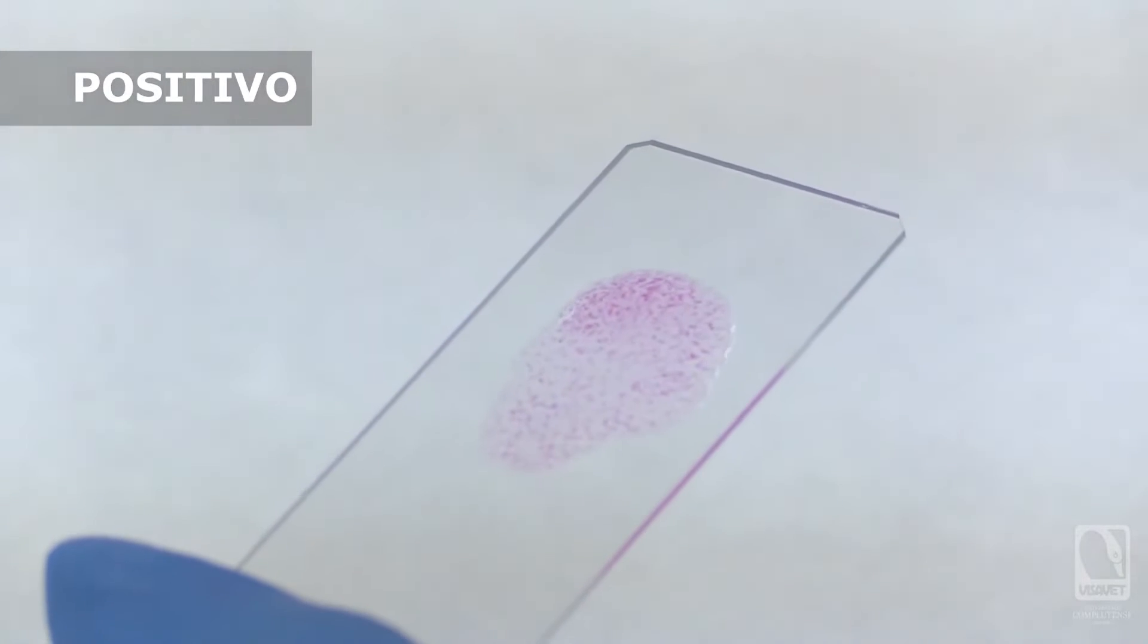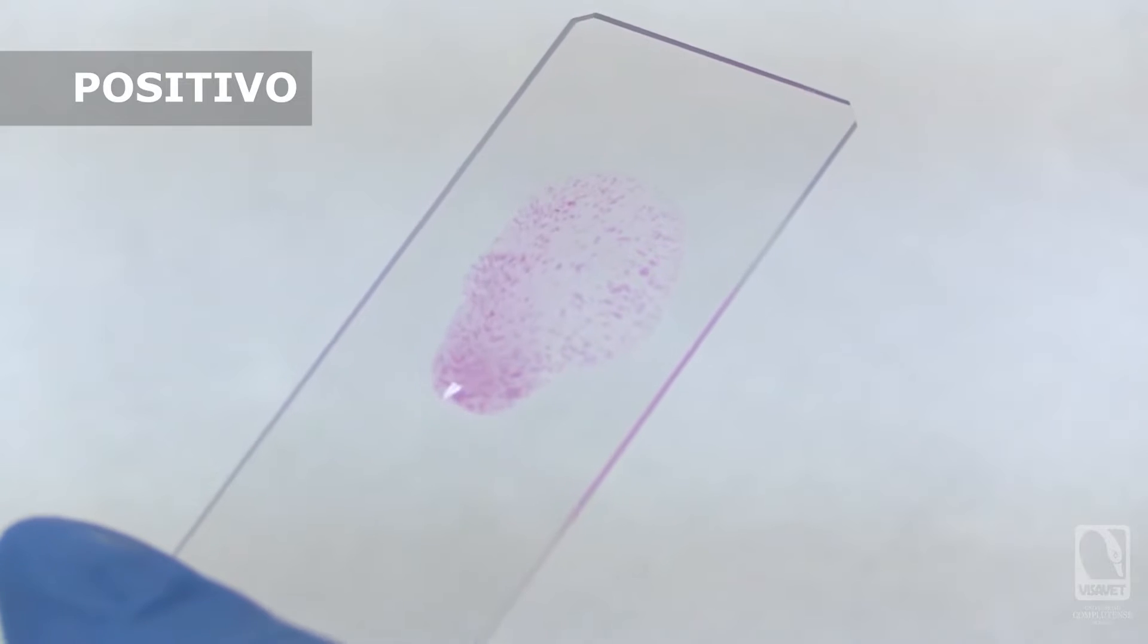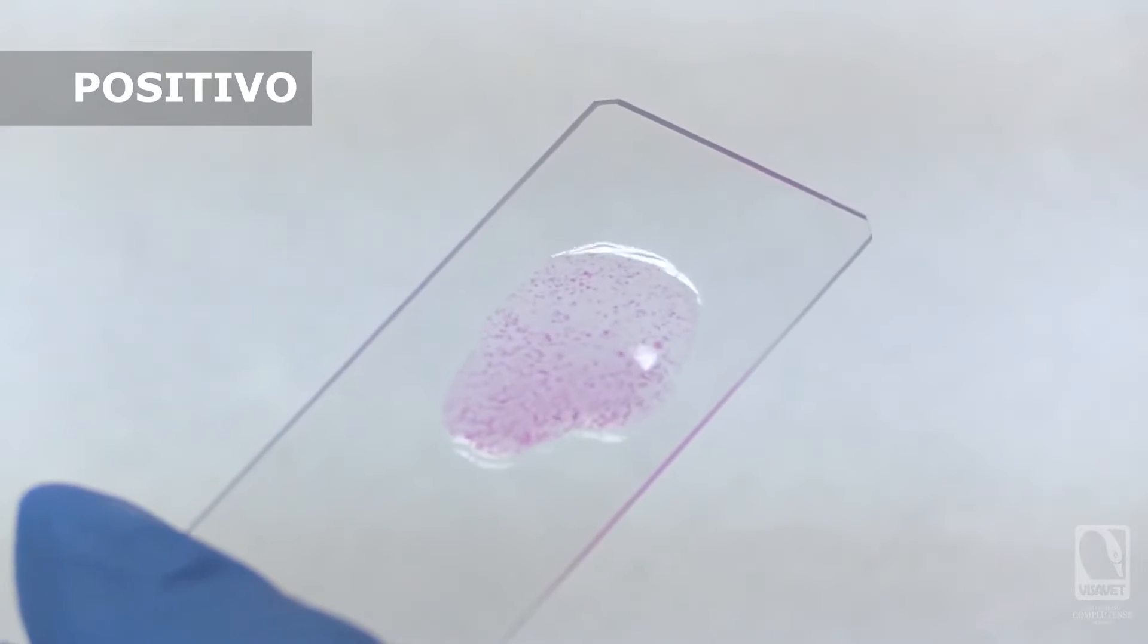If our test results show a positive sample, we will see the formation of distinct pink lumps. This agglutination will be clearly discernible, which we can see clearly thanks to the dye I mentioned before.